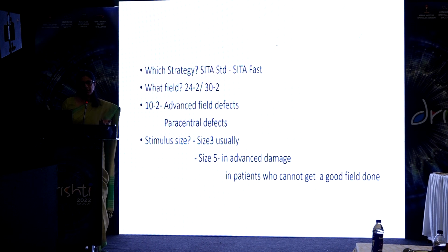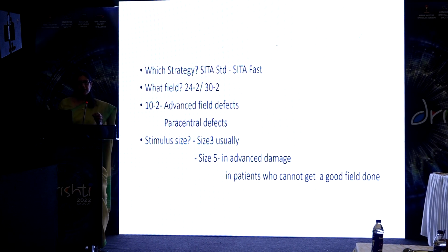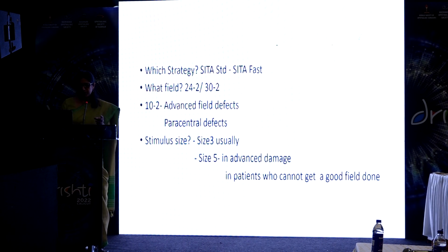So that also you can do. Stimulus size, usually size 3, and you stick to the same stimulus size, don't change it. But changing to a larger size, a size 5, is good in advanced cases. You can try in advanced cases. You can see the monitoring is better if you use a larger stimulus size.